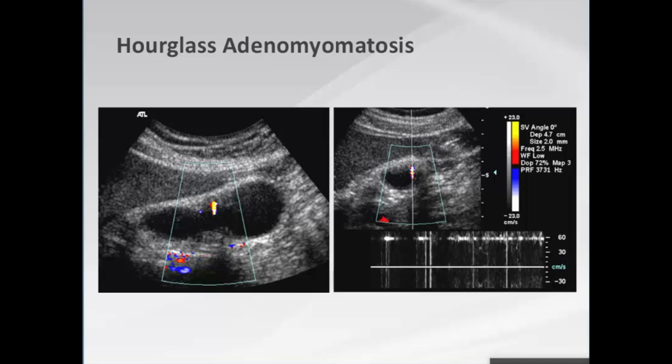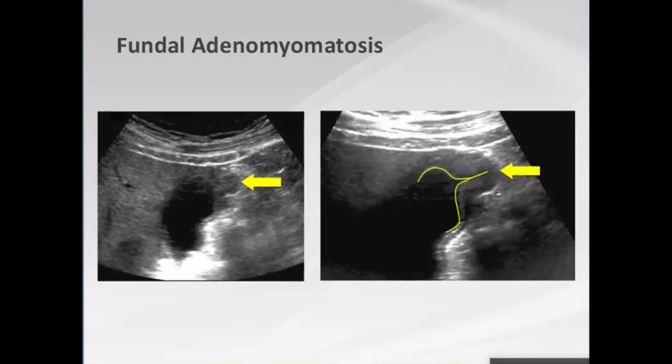Fundal adenomyoma shows thickening of the gallbladder fundus. With a higher frequency probe, an intact mucosa can be seen. This thickening is very typical of fundal adenomyoma and is not gallbladder cancer.